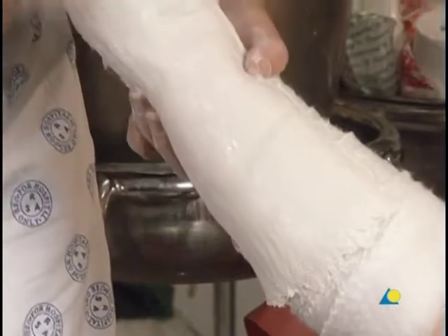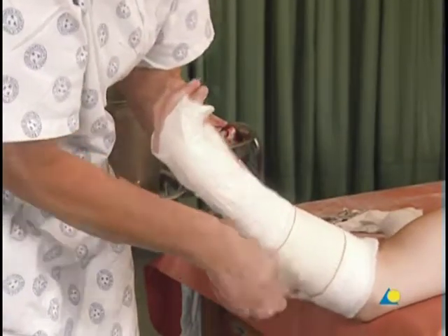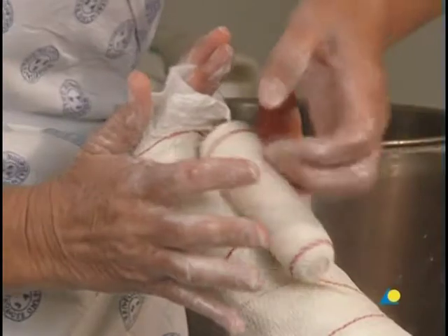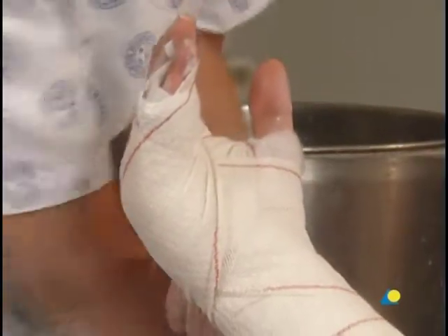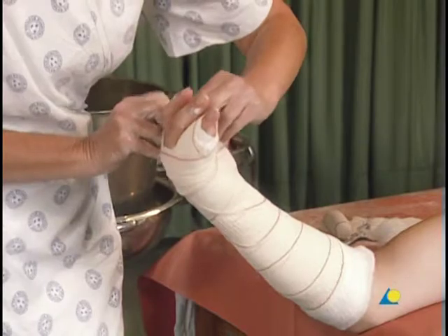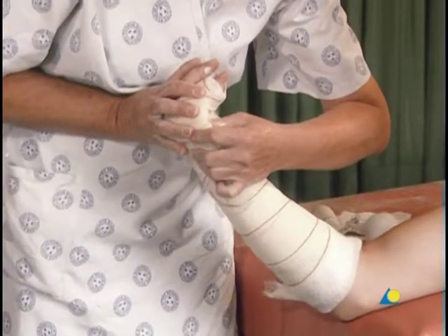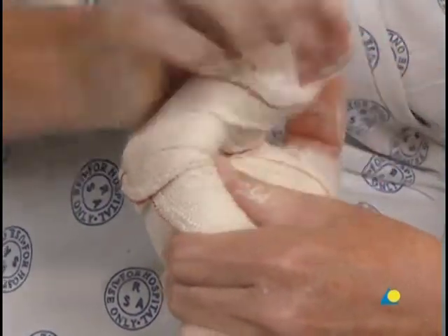Dorsal molding will correct any dorsal angulation. Beginning at the proximal end, the slab is secured in place by winding a crepe bandage around the forearm and wrist. The bandage should pass through the first web space, around the wrist, and then around the fingers to be secured. Any excess bandage is unnecessary, so the end of the bandage is trimmed. The plaster is now molded with pressure from two fingers around the shaft of the metacarpal and the thumb over the head of the metacarpal. Counterpressure is applied with the other hand to ensure 90 degree flexion of the MP joints, to prevent stiffness.